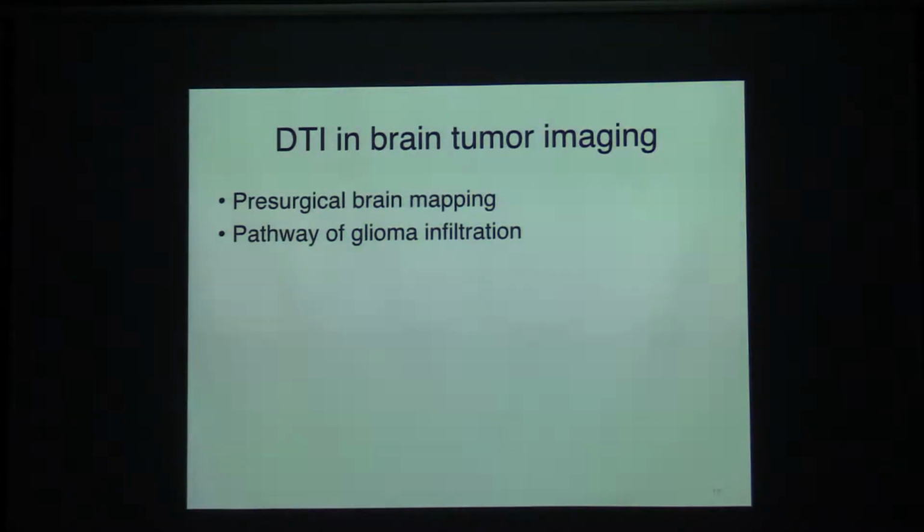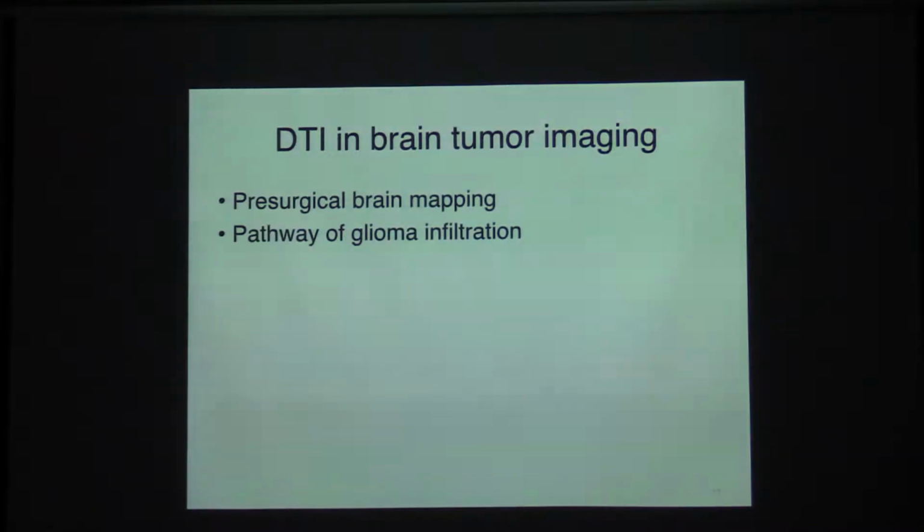The problem is that in practical use, I haven't found DTI to be really that useful for that kind of stuff. There's tons of things in the literature about abnormal DTI in trauma, brain tumors, seizure patients, etc., but it's really hard to get correct numbers across institutions.